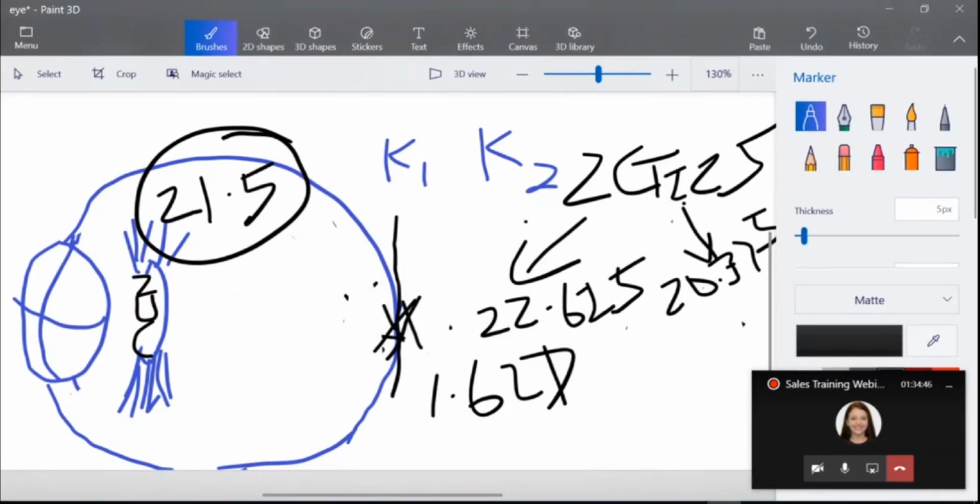much closer together. So toric IOLs help us to correct the astigmatism by giving you two different refracting powers on the lens, to bring the two focal points closer together.